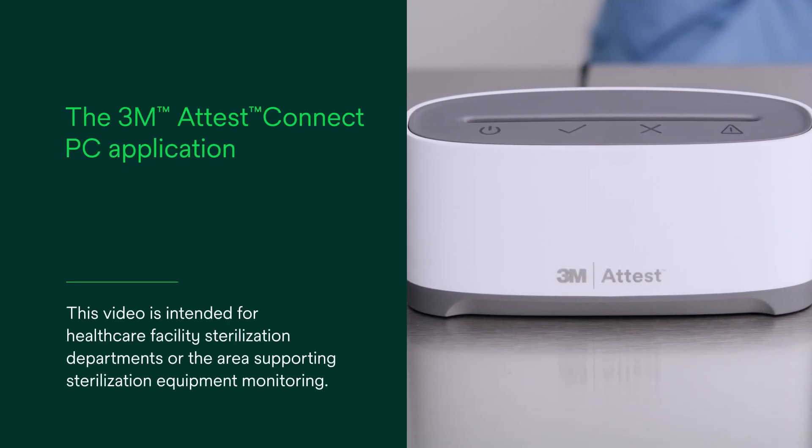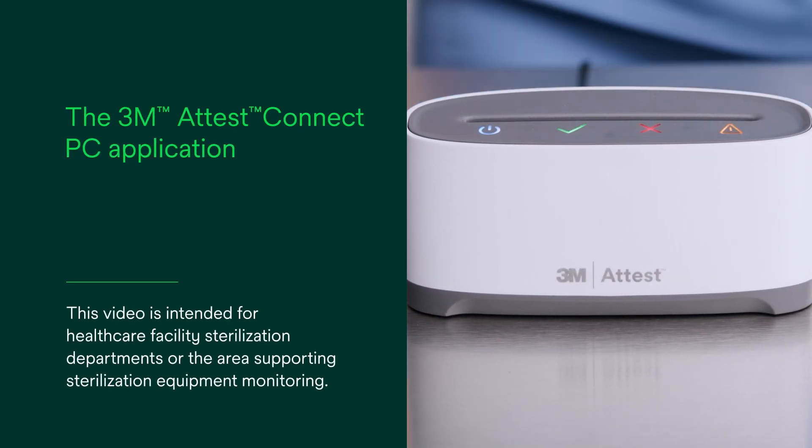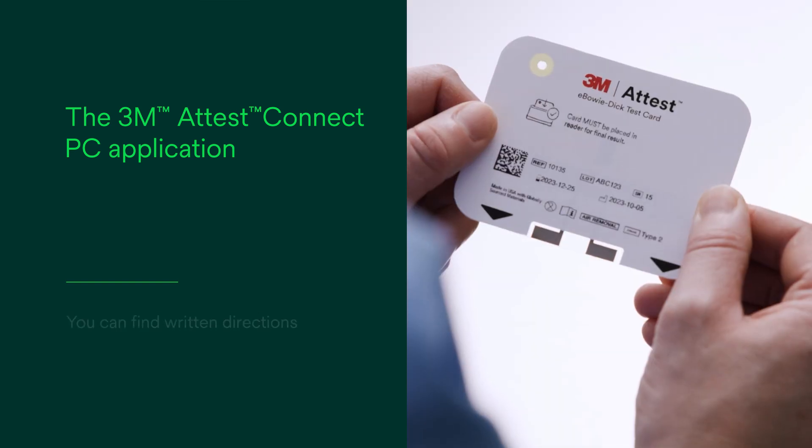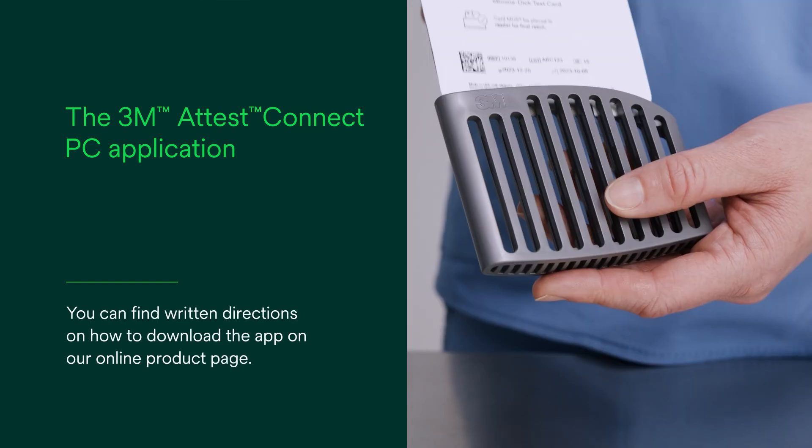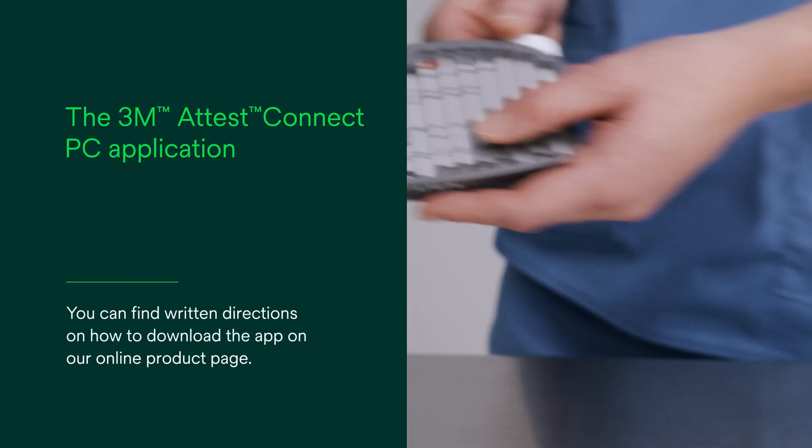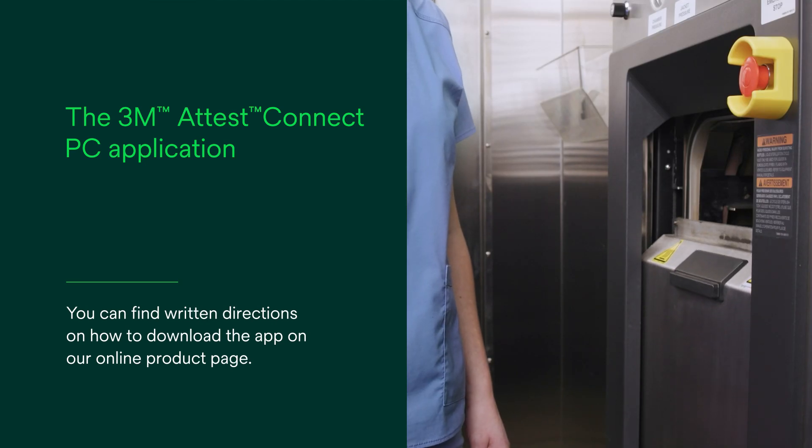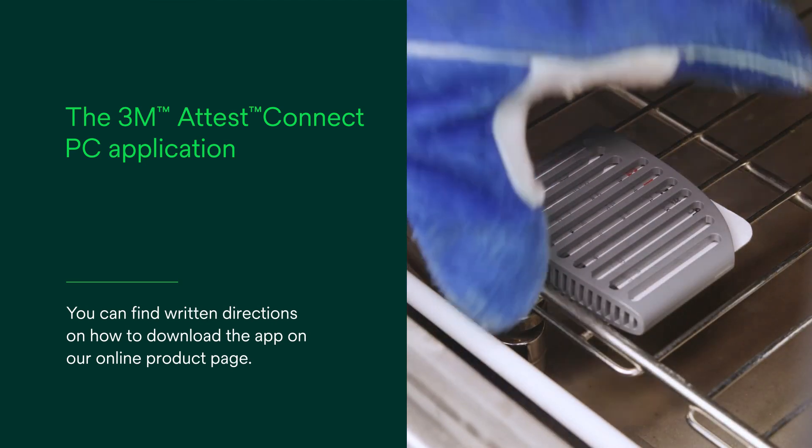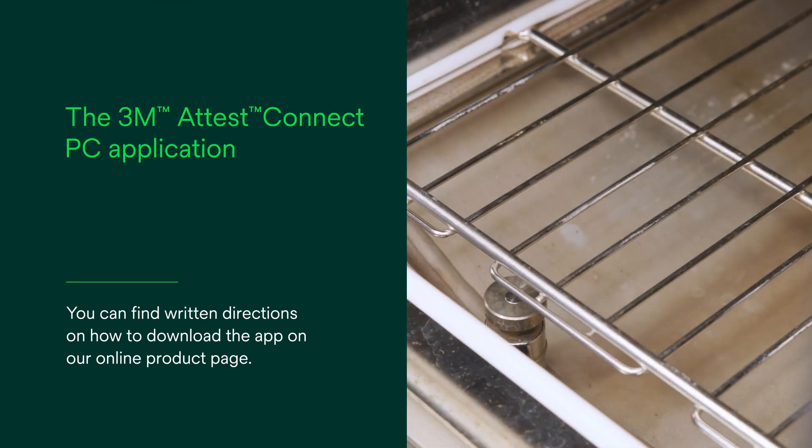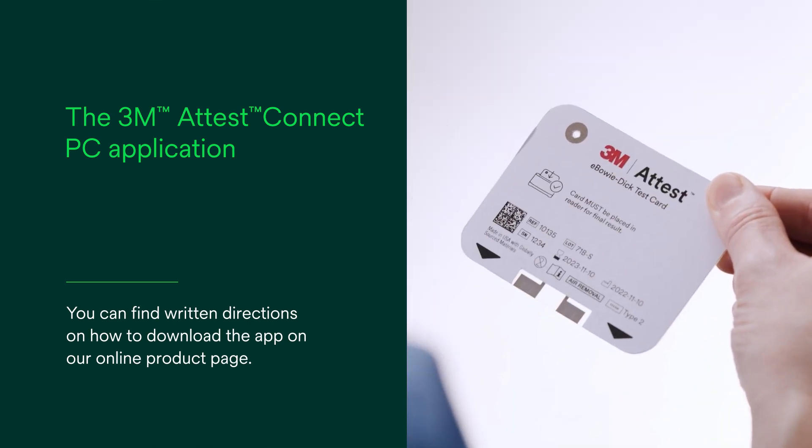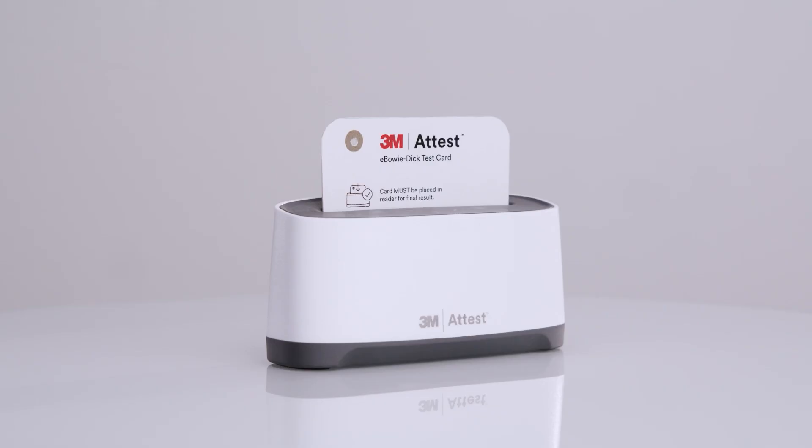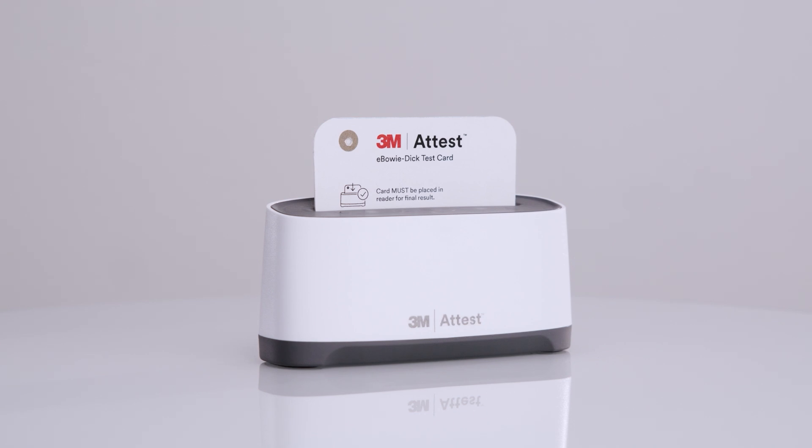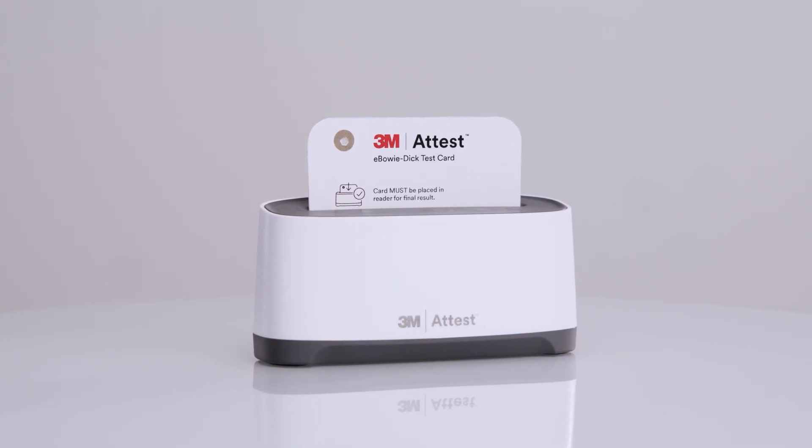Let's get started with the 3M Attest Connect PC application, which is used with the 3M Attest eBowie-Dick test system. This video will help you simplify, standardize, and streamline your sterilization process using your 3M Attest eBowie-Dick test system, the first of its kind automated digital sterilization testing system.